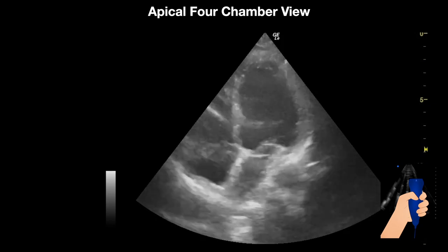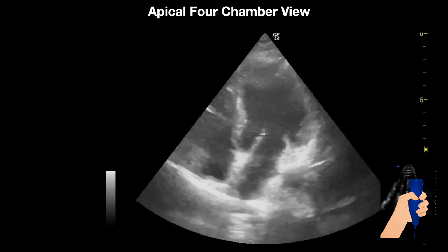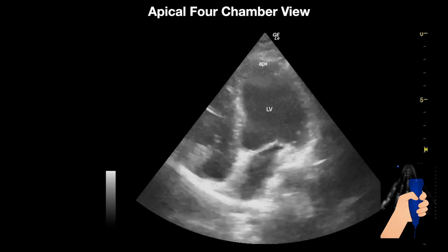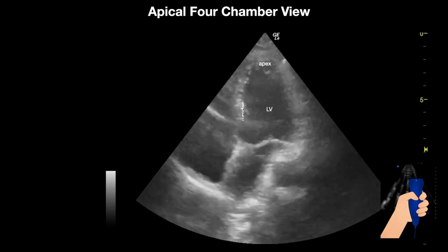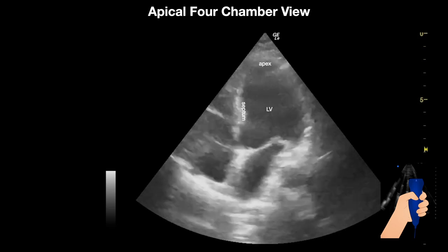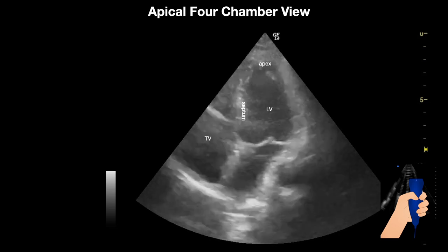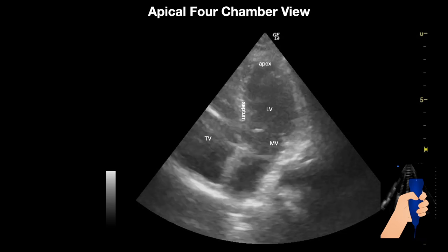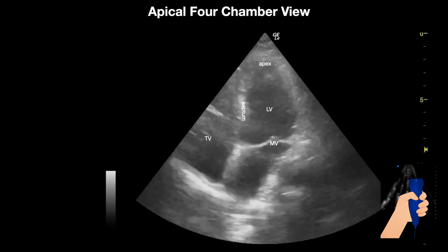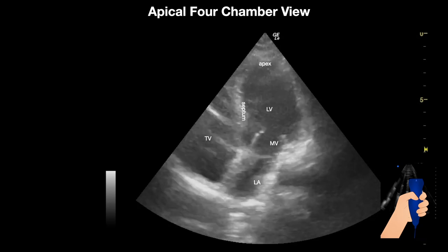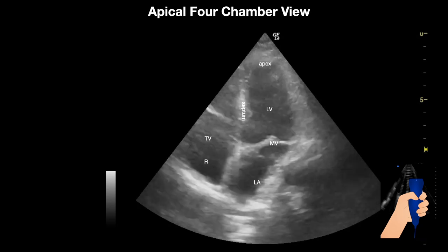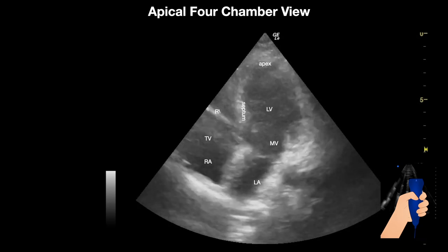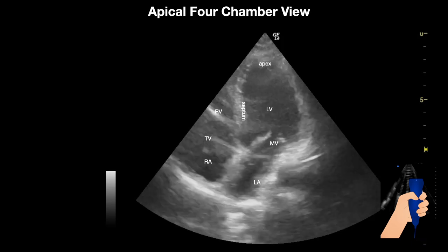In this image we can see the left ventricle, the apex, the septum, the tricuspid valve, the mitral valve, the left atrium, the right atrium, and the right ventricle.